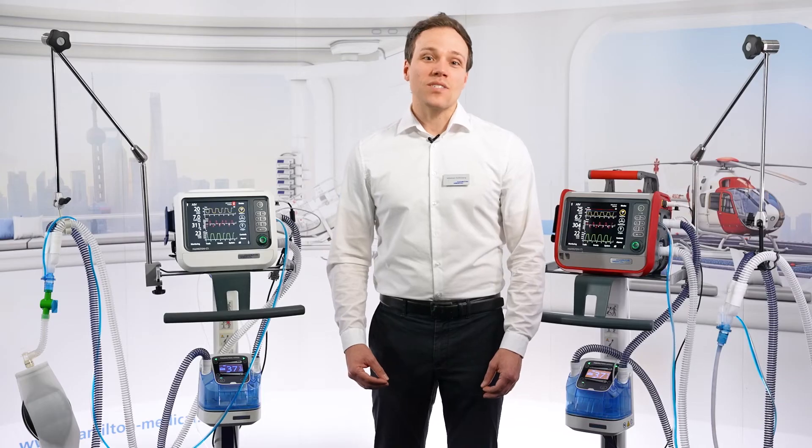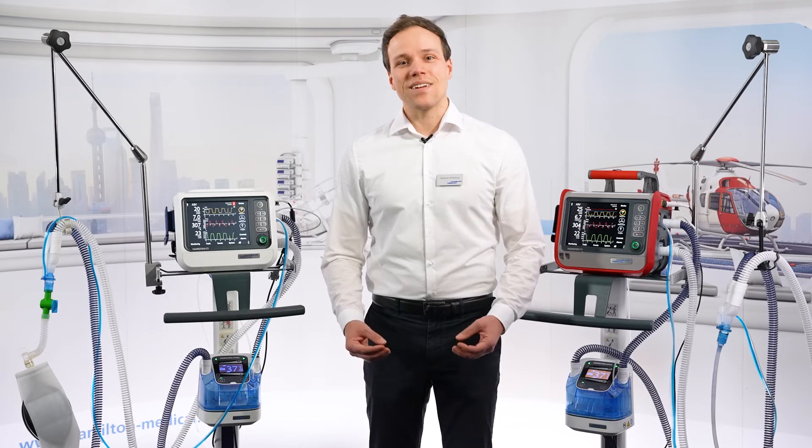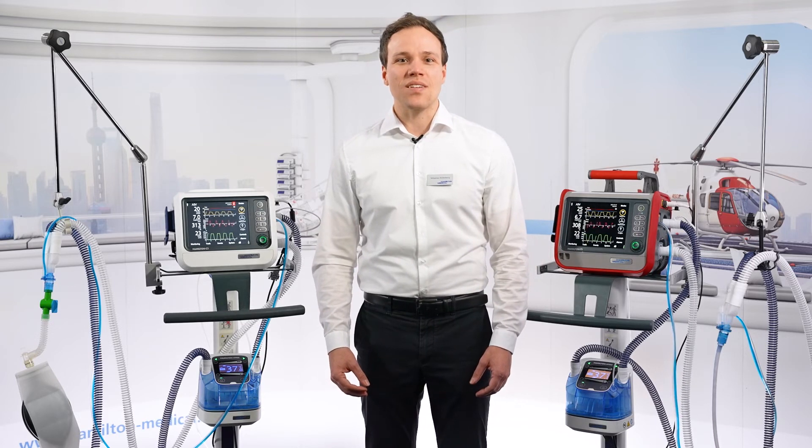Lastly, we also display the Hamilton H100 and the points where temperature is measured graphically. We believe that doing this will help users understand the device better and utilize its features more, which might also benefit the patient.